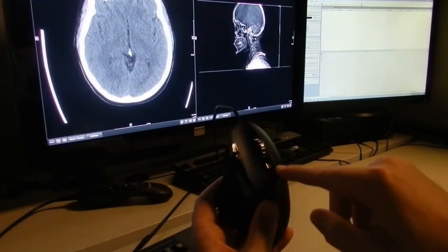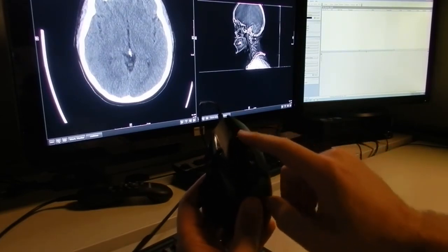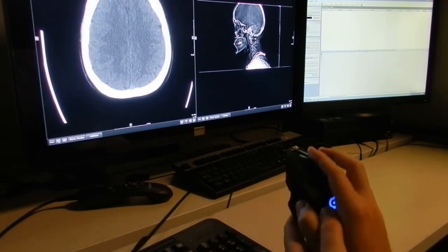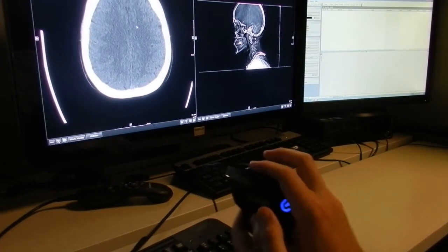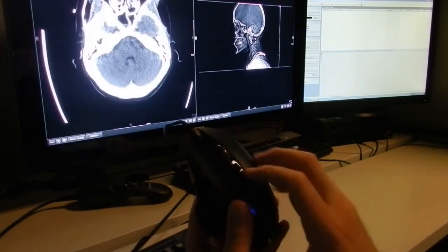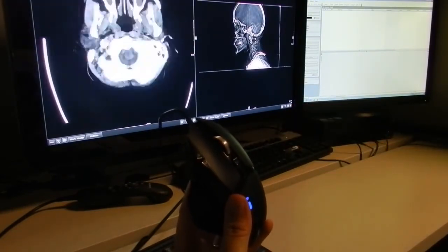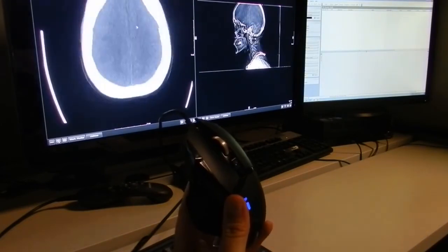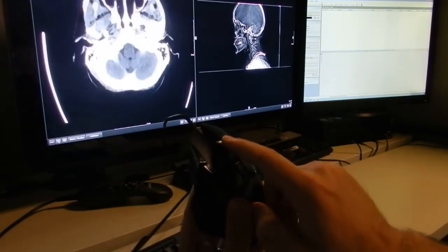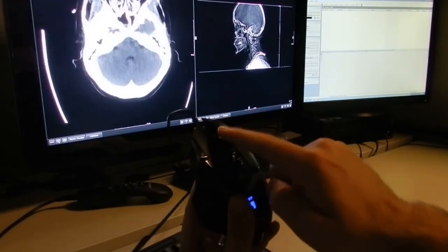Finally, I want to show the scroll lock. Normally the mouse is going image by image, and then you'll hear a clicking if you try to do it quickly. You can take the scroll lock off, and then the wheel will free spin and give you kind of smooth scrolling. It's very easy to stop, but it's very touchy. It's hard to stay on one image, and so there's reasons to put the lock on and take it off.